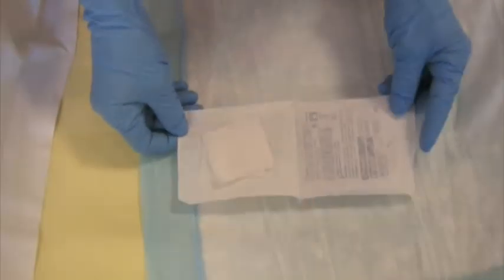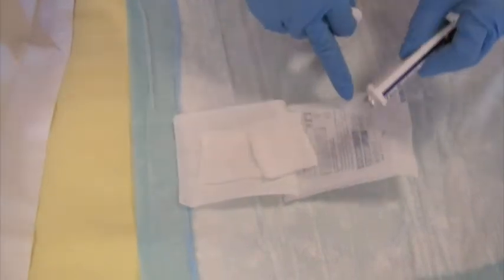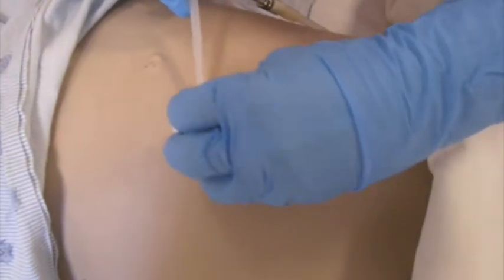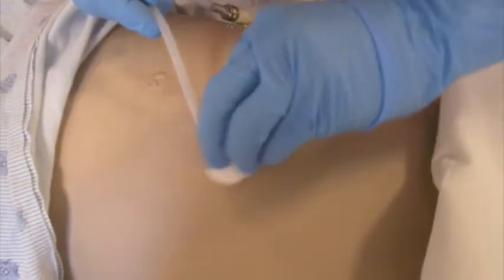Taking your second 2x2 gauze, open it up. Apply your 2% mupirocin ointment on the sterile field. Take your gauze, fold the corners, ensuring that you use a no-touch technique.